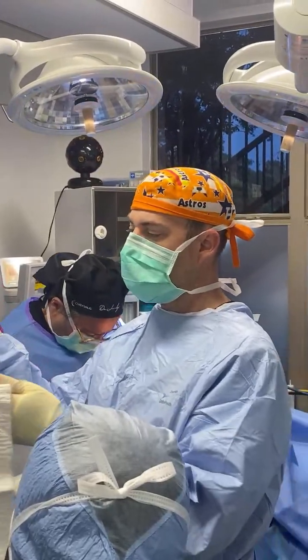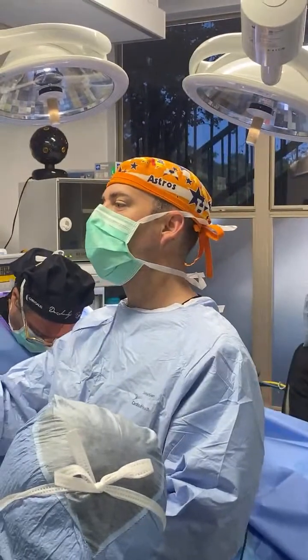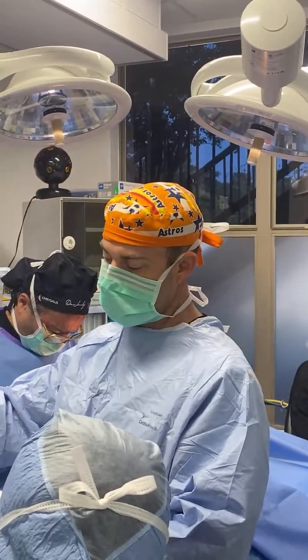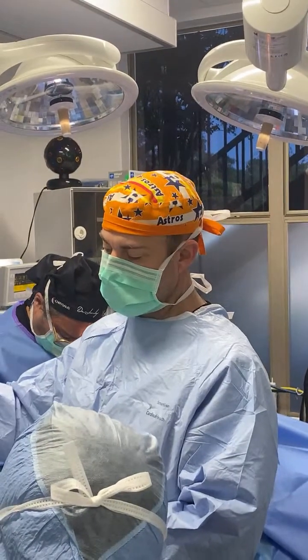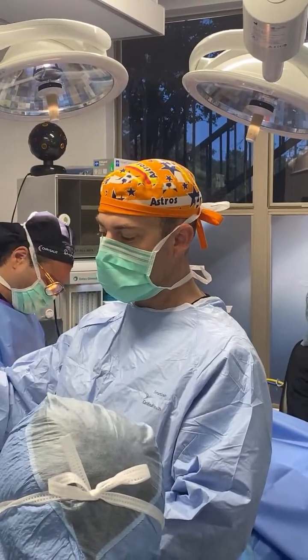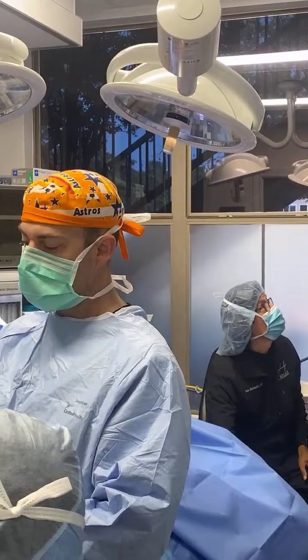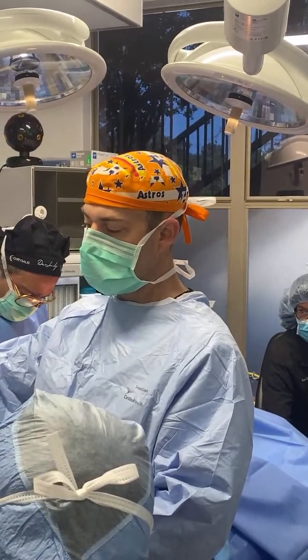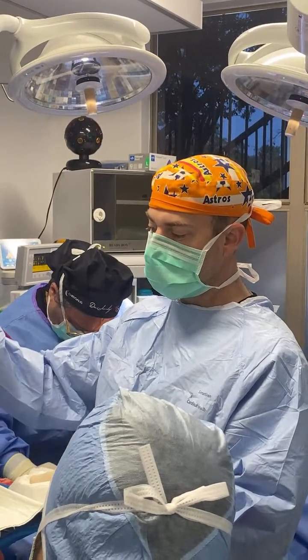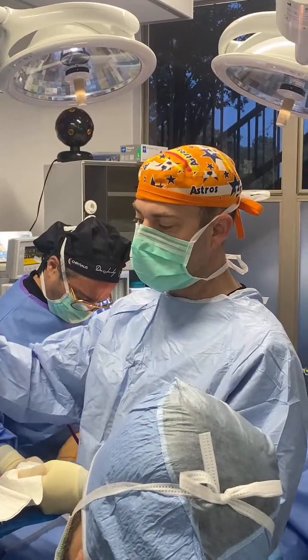Hi everyone. For those of you who are just getting on, we are doing a lipo 360 on our patient today with a BBL and Renuvion. We're on the second part of that surgery. So earlier this morning we got started about 7:30. We had our patient laying on her backside, and we started with the lipo 360, so taking fat from her sides and her abdomen, collected that fat, took a break, and flipped our patient over onto her stomach to finish the lipo. And now we're doing the BBL portion.